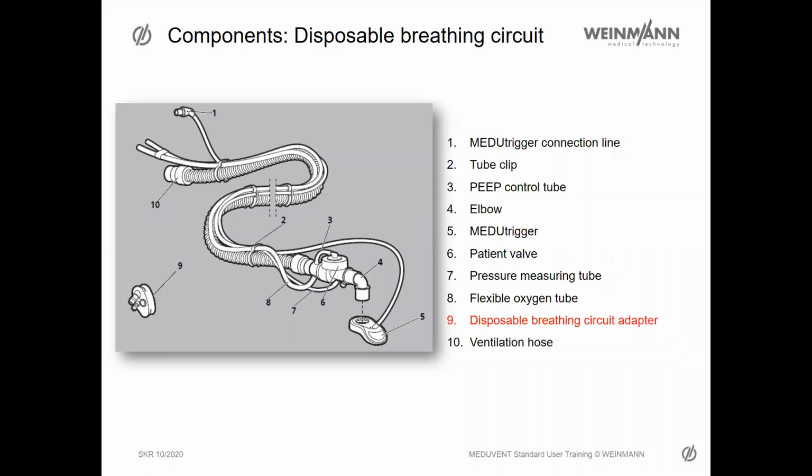How to incorporate RSI with the MEDUVENT? That's mainly with the manual mode. You can ventilate the patient with the manual mode and then change into IPPV or another mode on the device. Same question above: yes, we can proceed with RSI with the MEDUVENT, not as a single mode, but we can do it.